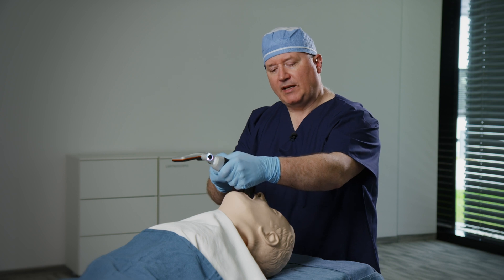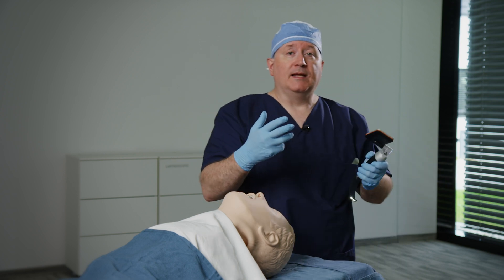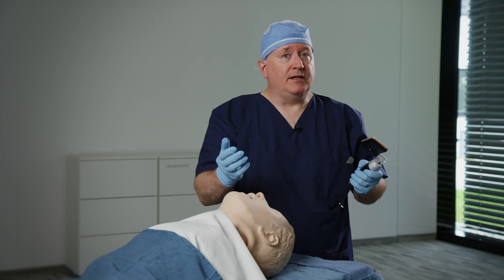So in summary, by using the free hand, we can facilitate both direct and video laryngoscopy.